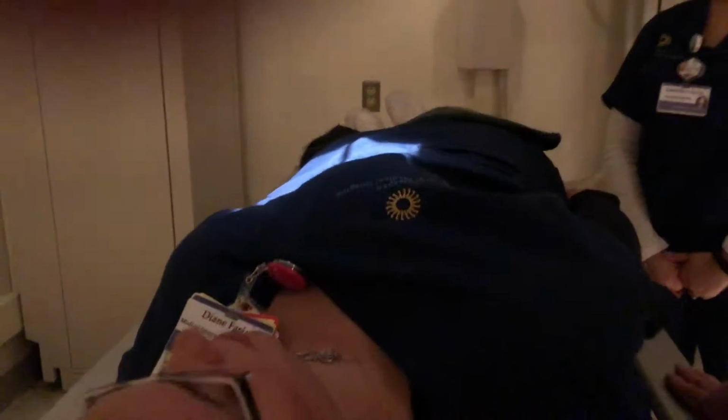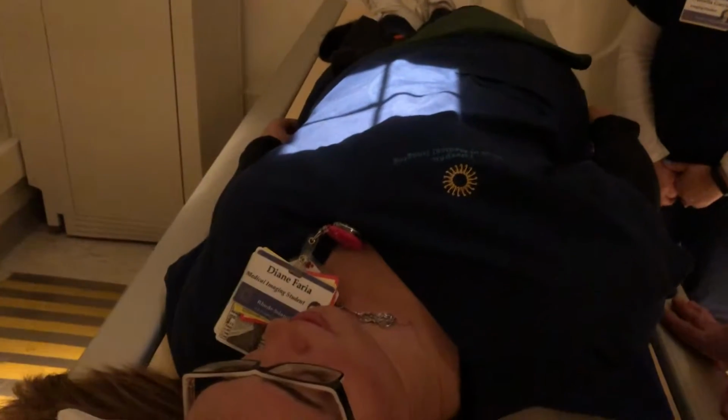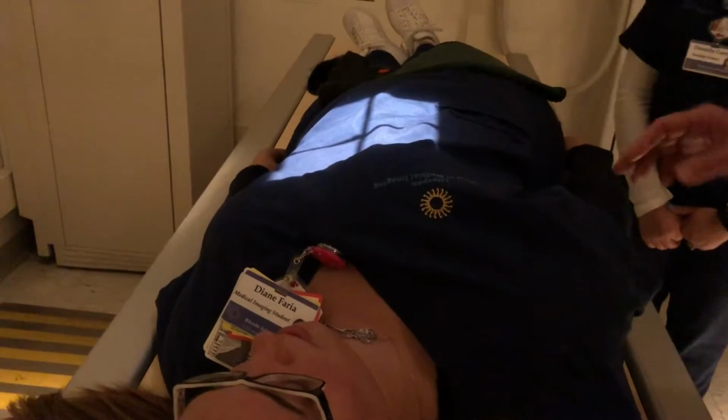It's a little deceiving because where her spine is, you want to make sure you're all the way to her spine. If you feel back here, the spine actually moved that way, so we're going to have to make sure we're centered and at least have the spine on the image. So we're going to be centering right there. So L1-2 for a sthenic type patient, and her obliquity is about 40 degrees, 45 degrees. So that would be our LPO on a sthenic type patient.